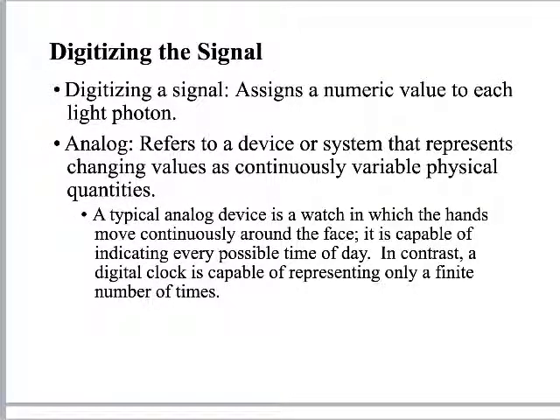All right, so that's all really good and well. We've got the slow scan direction, the PSP plate moving through the reader. We've got the fast scan direction, the laser slicing across it, this red laser. The PSP plate's giving off blue light. The photomultiplier's picking up that blue light, but that's an analog signal, right? That's just blue light. What we need to do now is convert that to a digital signal, and this is what we're going to do. We use an ADC, an analog to digital converter. We digitize this signal, so we assign numeric values to the amount of blue light. There was more blue light here than over there. That's given a number, right?